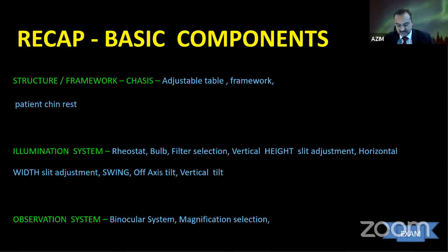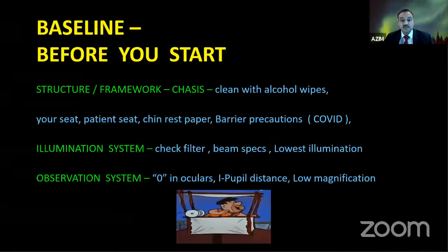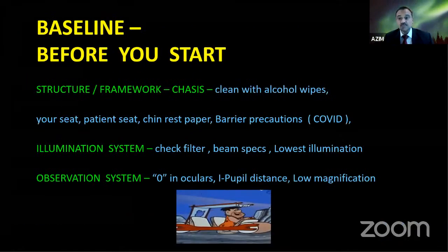Now that we know the basics, let's go slightly forward. Before you start, remember to clean with alcohol wipes.